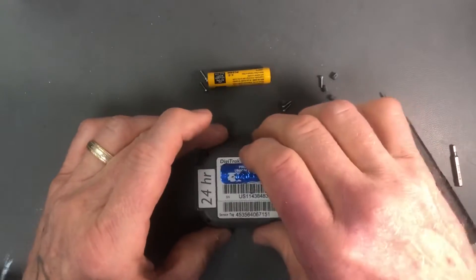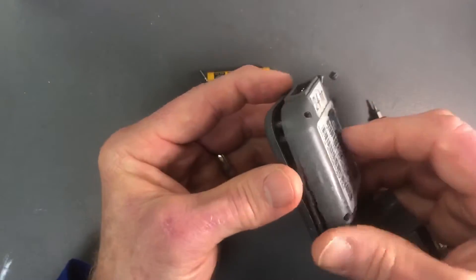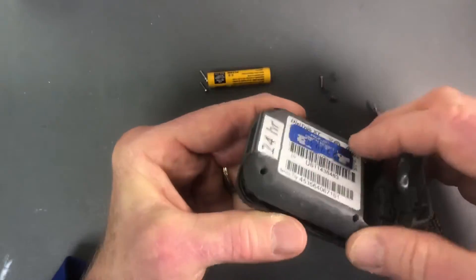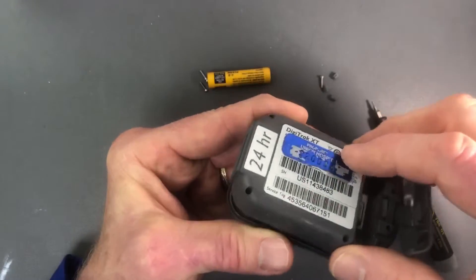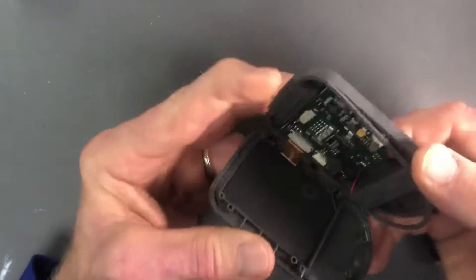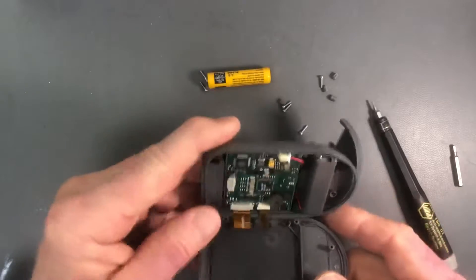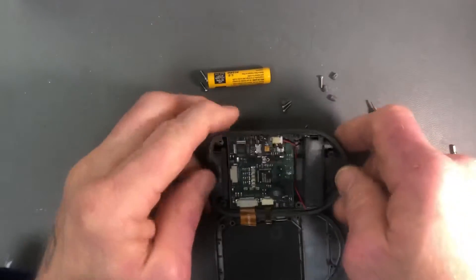That will allow you to very carefully open this compartment. You have to be careful — you want to open it from the negative side of the battery and swing it open in this direction, because there are ribbon cables down here that you don't want to accidentally rip if you open it from the opposite side.